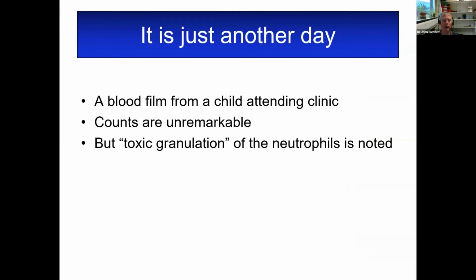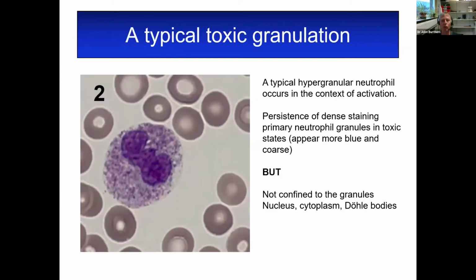So this was just another day in the laboratory, and I wasn't in the laboratory at the time, but I think Ben, our microscopist, received a blood film made from a child who was attending a paediatric clinic. The counts that were sent across to us were, I believe, unremarkable. But some toxic granulation of the neutrophils was noted. Now I say toxic granulation, but it wasn't, but we'll come to that in a moment. Let's first review what typical toxic granulation looks like.